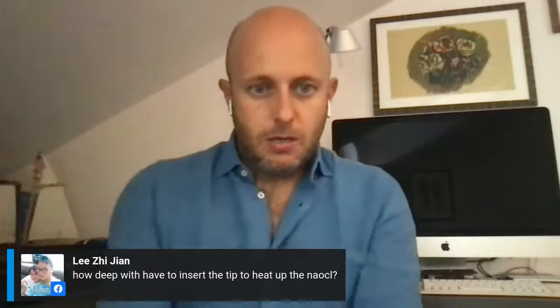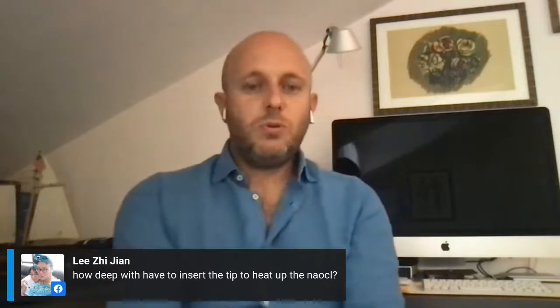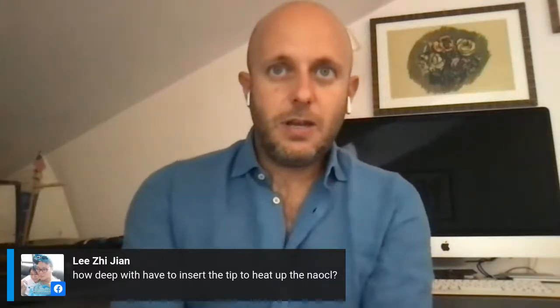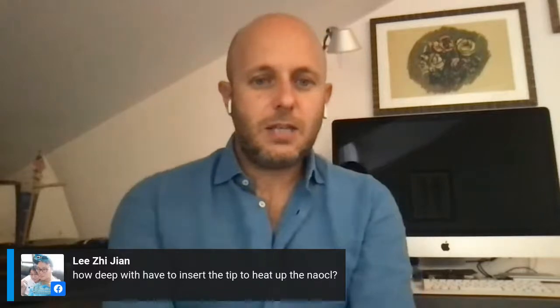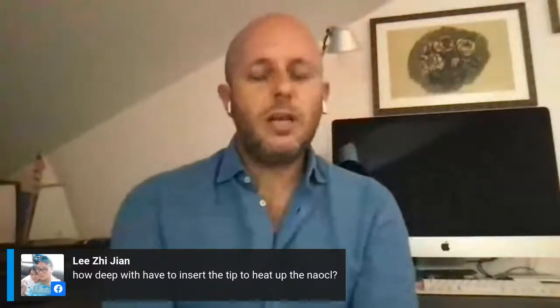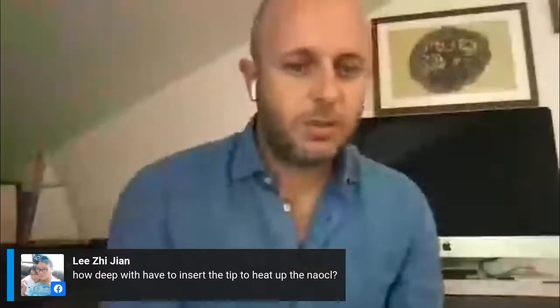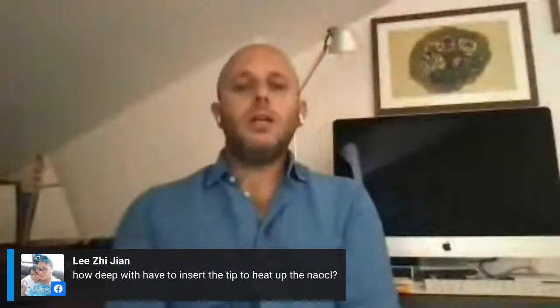The deepest as possible. We are used to work with small tips. The Buchanan tips, you can find the 30 as apical diameter and 4% of taper. The 30/04 is the one I use in daily practice until 3-4 millimeters to the working length. So you have to go the deepest as possible in the root canal, until 3-4 millimeters shorter than the working length.